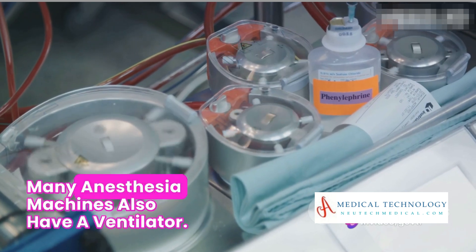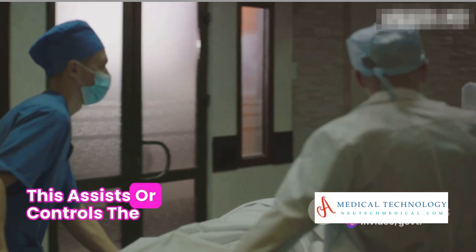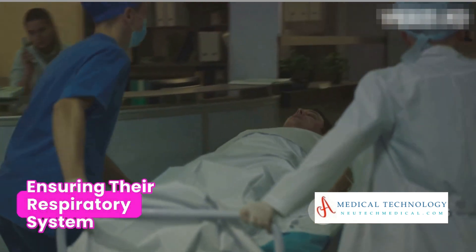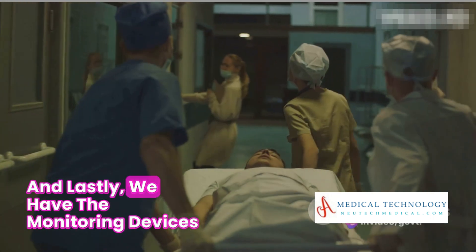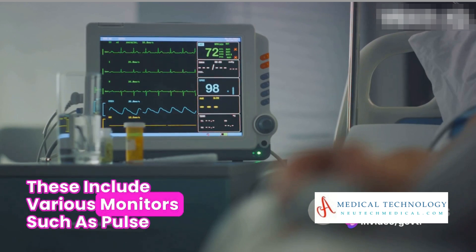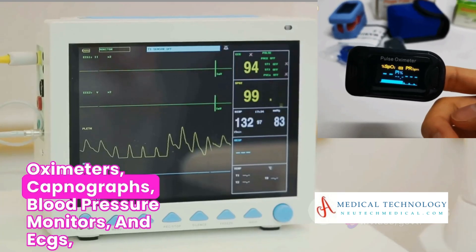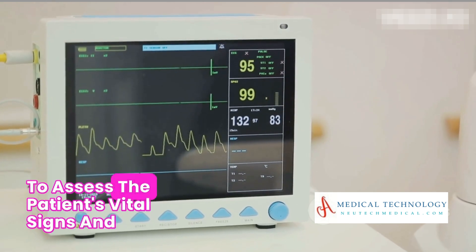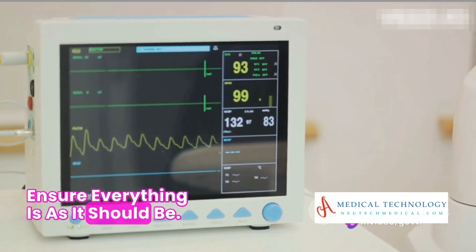Many anesthesia machines also have a ventilator. This assists or controls the patient's breathing during the procedure, ensuring their respiratory system functions as it should. And lastly, we have the monitoring devices. These include various monitors, such as pulse oximeters, capnographs, blood pressure monitors, and ECGs, to assess the patient's vital signs and ensure everything is as it should be.